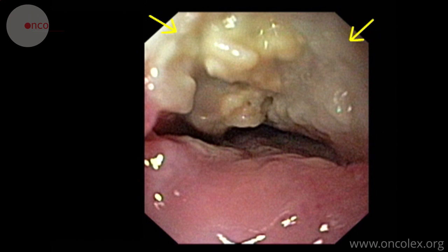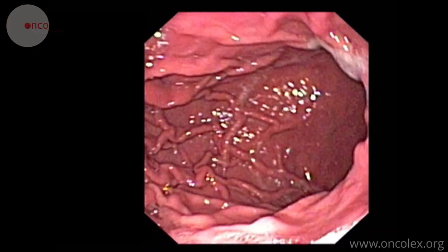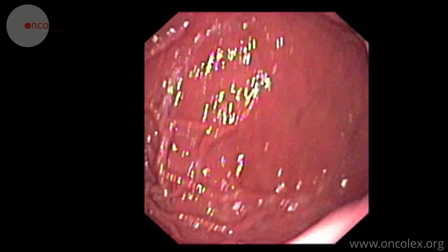Here we see the upper part of the tumor. The scope is moved past the tumor area and down into the stomach, which is inspected for pathological findings.